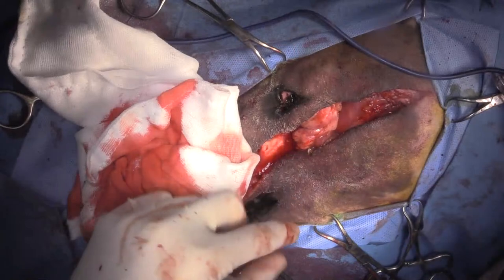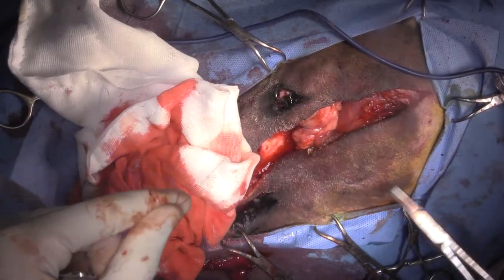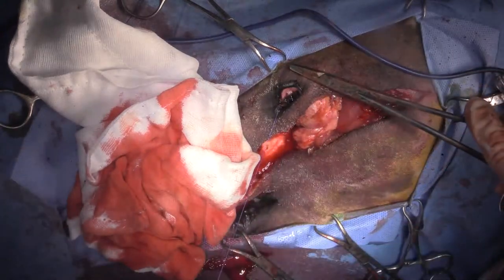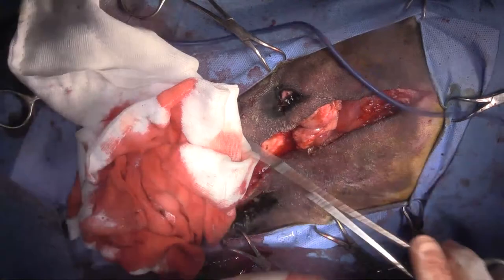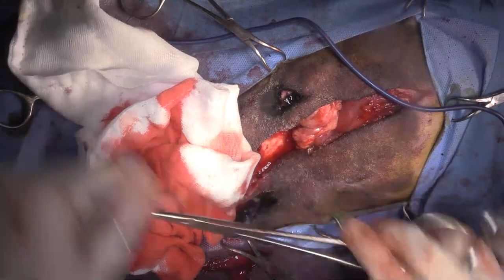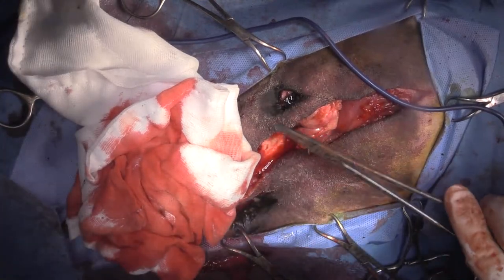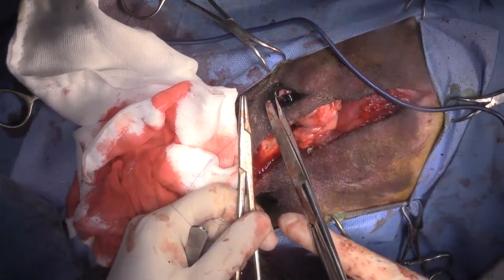Question about the type of cancer in a six-year-old dog. Yes, that is quite normal. If you had dirty margins, would a closed suction unit also increase the area needed for recut? Yes, it would. But I don't think a recut would be possible in this area anyway. So if we did get a dirty margin, I think we'd be thinking about either radiation therapy or metronomic chemotherapy. The sponge that we use is gel foam.